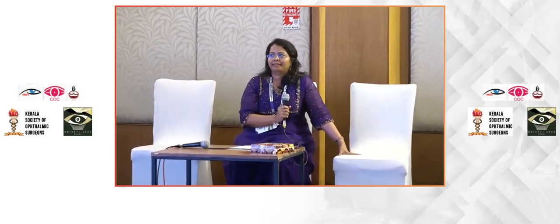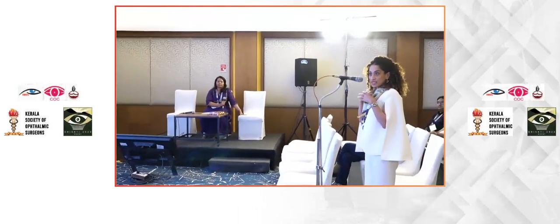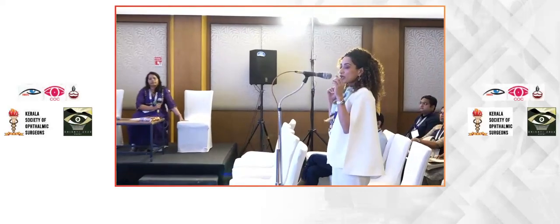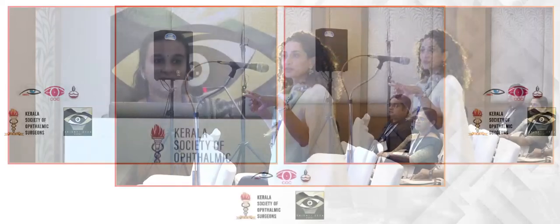Excellent presentation. Just 2 things: when you were telling that you were not able to dissect the conjunctiva and Tenon's, one thing is, if it's inflamed, brimonidine topical eye drops help. The second thing is you should inject lignocaine and adrenaline in the subconjunctival space. One, it gives you hemostasis, and it also separates the conjunctiva and Tenon's.